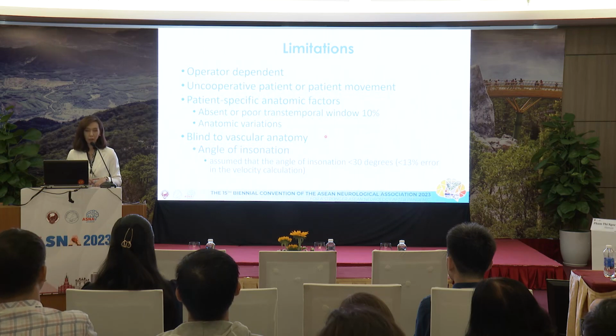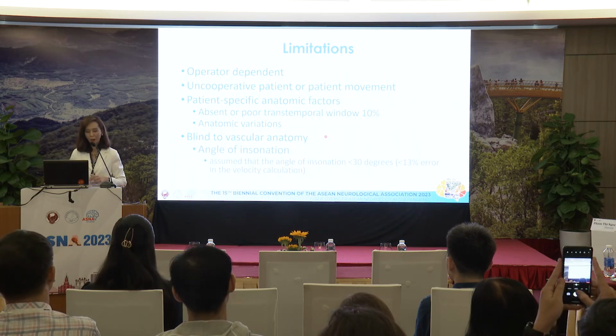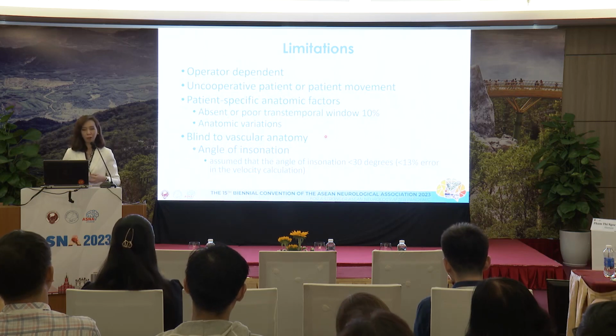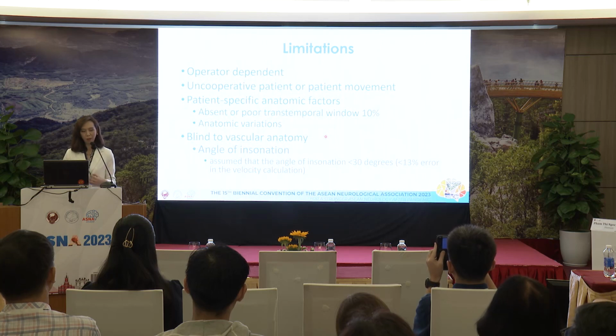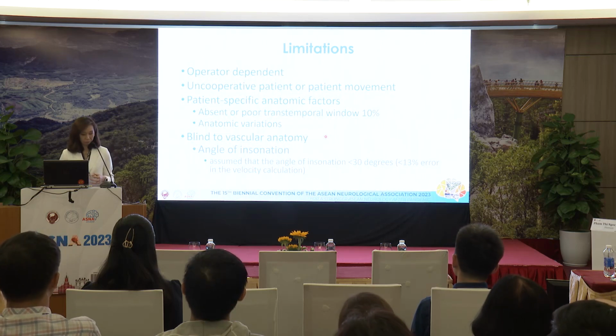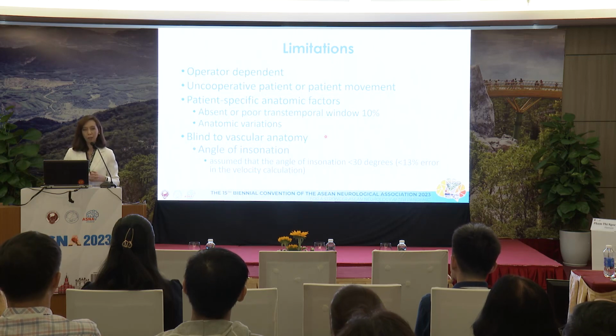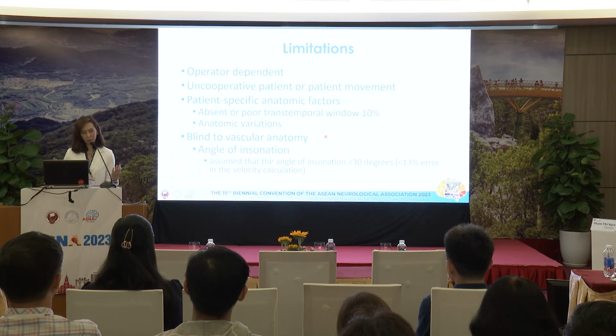There are some limitations. Of course, it's operator dependent. We don't see the arteries, so it depends on you to define the arteries. And in patients who are not cooperative, they're moving around, maybe it's not very good. And there are some patients who had some anatomy factors which do not allow us to find the arteries. As mentioned earlier, some old Asian ladies would have a bad temporal window, maybe 10% of those we do TCD, we won't be able to find a window.